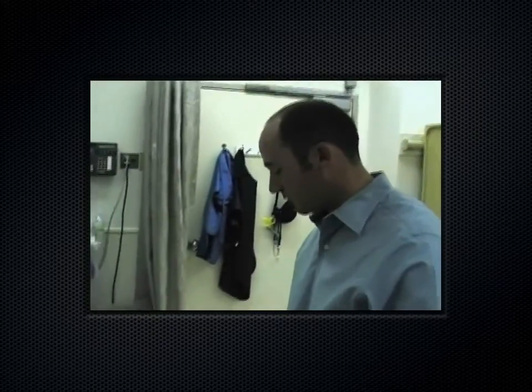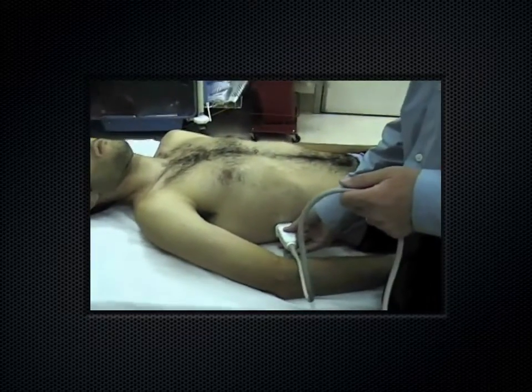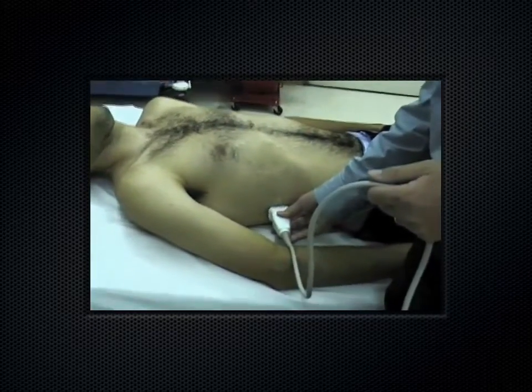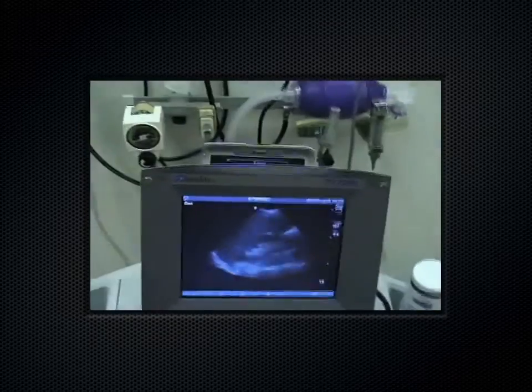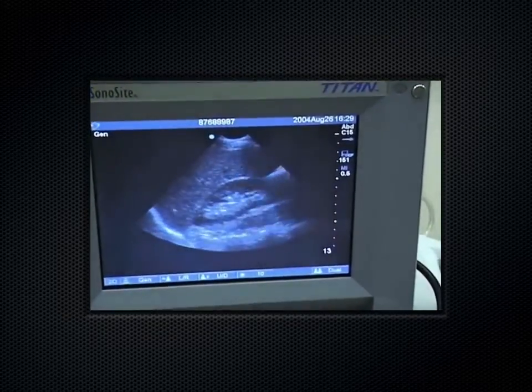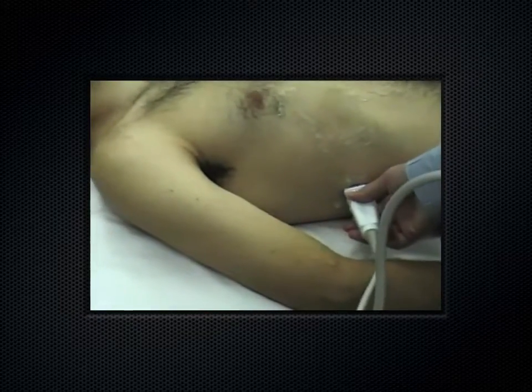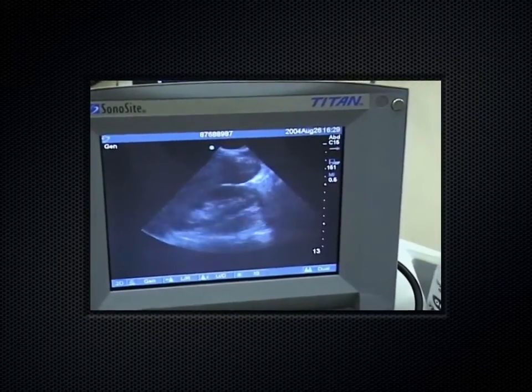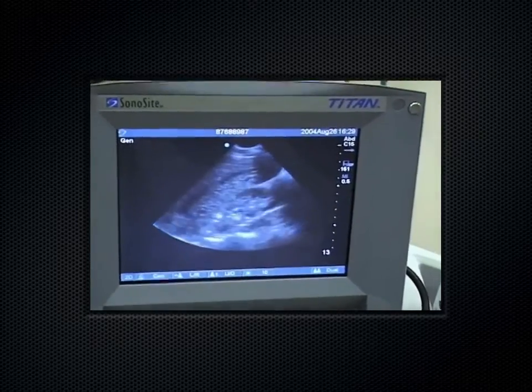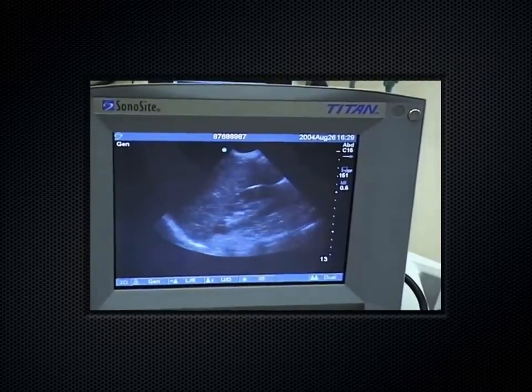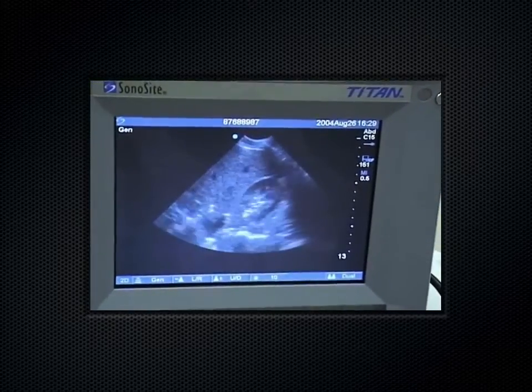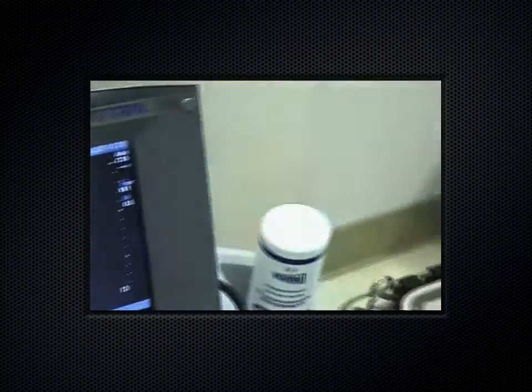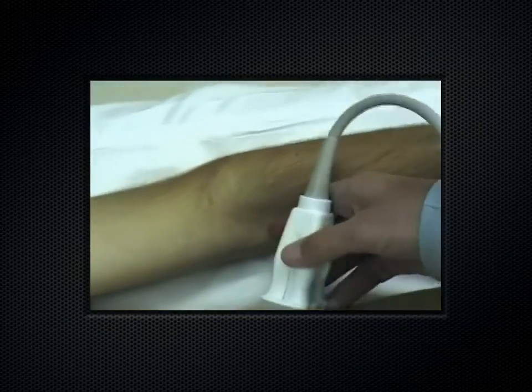Now if we talk about the renal scan—you pretty much did one during the FAST exam—you come over here and get a nice coronal view of the kidney. You can get the upper pole and lower pole on the screen at the same time in a long axis. If you rotate the probe 90 degrees, you can get a short axis of the kidney. You always want to fan through an organ in both its long and short axis. Indicator towards the patient's head to get that long axis; rotate towards the ceiling for short axis.